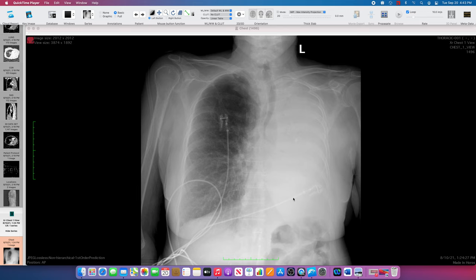If it's moving toward the opacification, as we see here in this chest radiograph, where the trachea is deviating to the left and the mediastinum and heart are moving off to the left, this means that there's volume loss in that left hemithorax, which is likely due to a central obstructive lesion. So we would recommend a CT here to evaluate for a left mainstem obstruction.